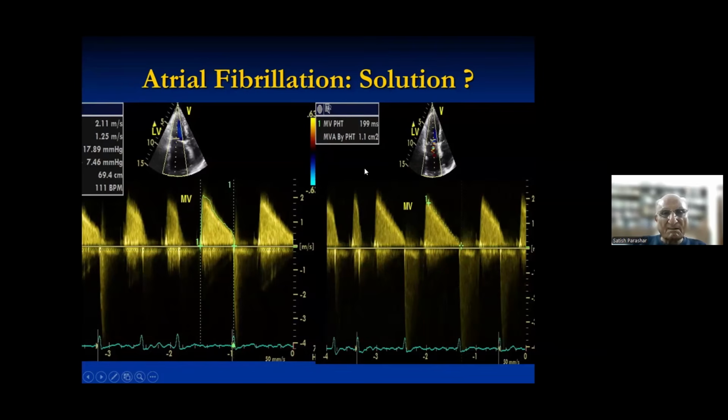Now remember, in a sinus rhythm, always take 3 recordings. Every recording you take, you can try when you are doing your routine echo. For example, suppose you take a mitral or an aortic Doppler. All of them will be variable.